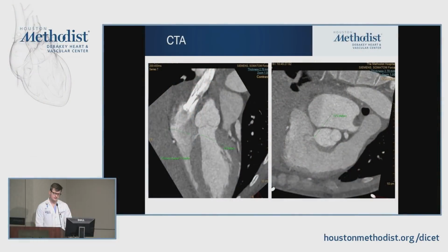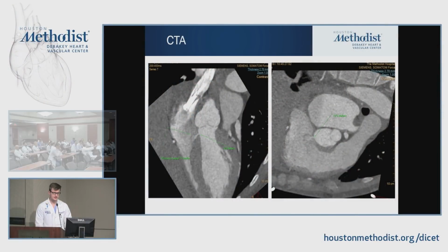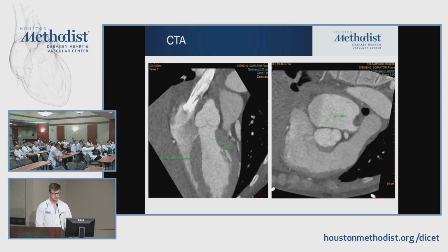That's why you chose CT in this case. I guess to investigate something like this further, you've got two options, really, CT or CMR. And so in this case, what was the rationale for choosing a CT? Basically to see the size, and second to assess the coronary anatomy for this patient, outside of the septal defect. Okay. Clinically, this patient is on dialysis, so I think those are the important things.